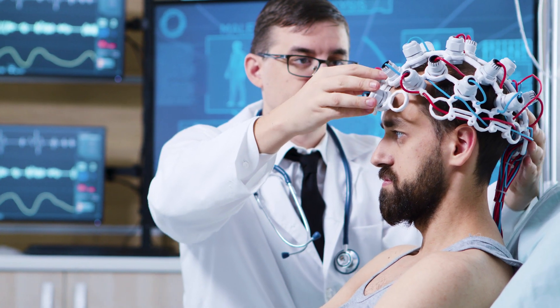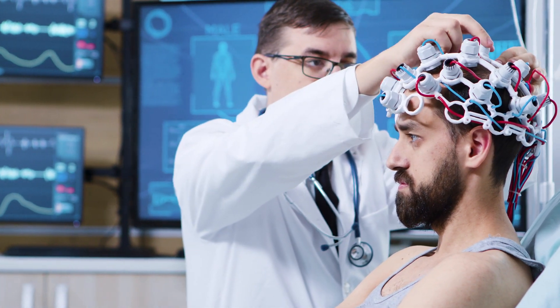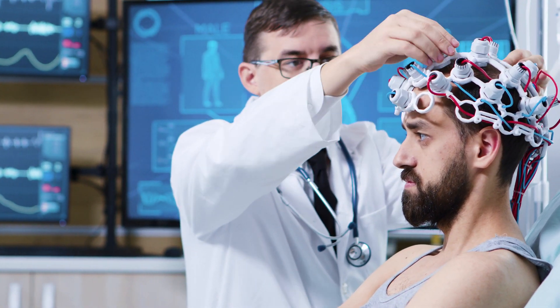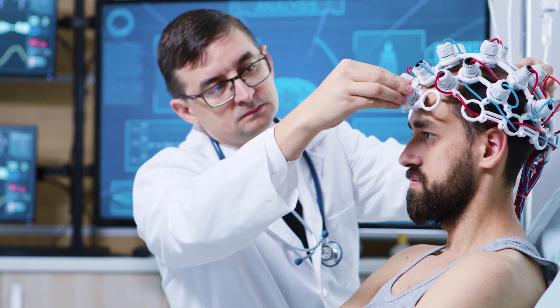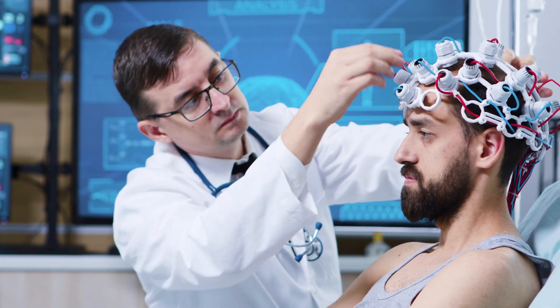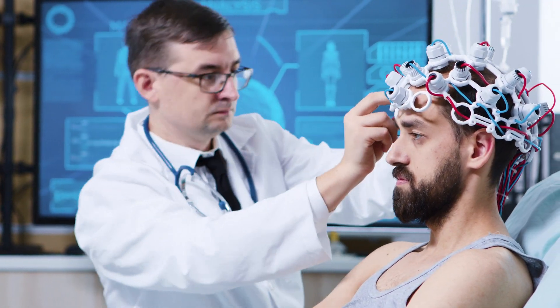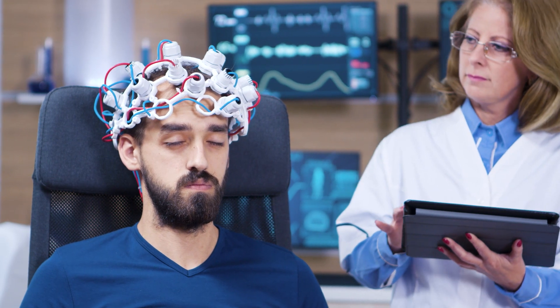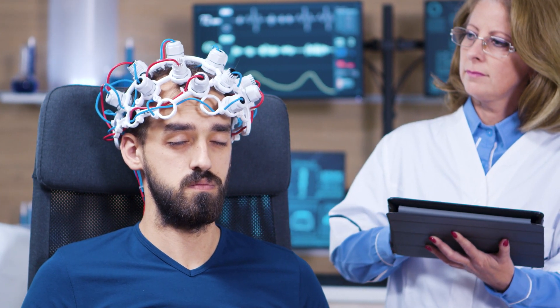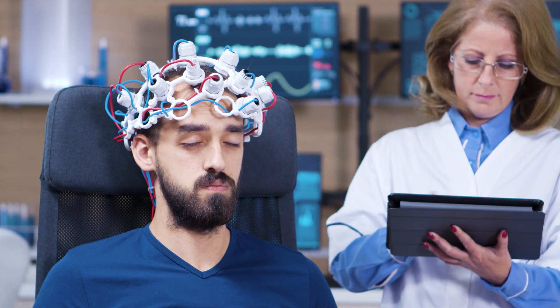This is also ideal in everyday situations outside of a laboratory, or in research labs hoping to expand the number of research subjects. EEG headsets can also be used for brain-computer interfaces.